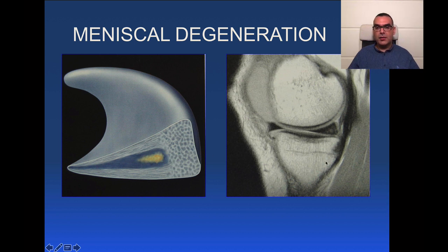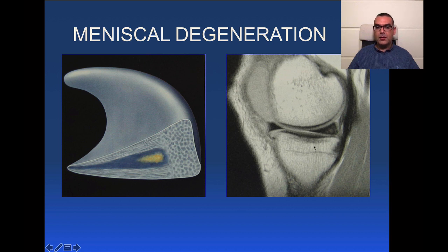Let's look at illustrative MRI images. First, meniscal degeneration: this is an intrasubstance hyperintense signal not reaching the meniscal surface. The inferior and superior surfaces are intact. This is the red zone — the meniscal base — where primary repair is possible. The meniscal apex should be a clear-cut, pencil-sharp triangular apex in the horns. Of course, a similar signal in a 16- or 20-year-old patient without trauma is not called meniscal degeneration.